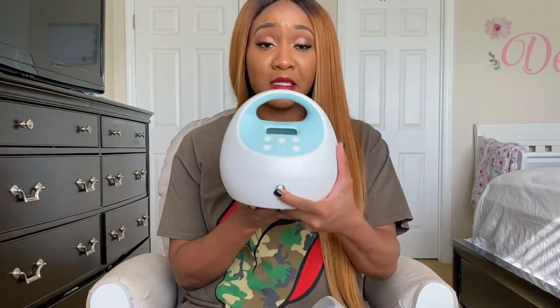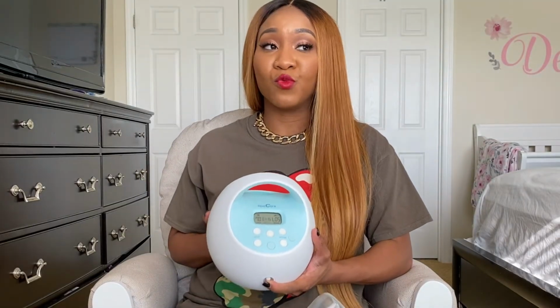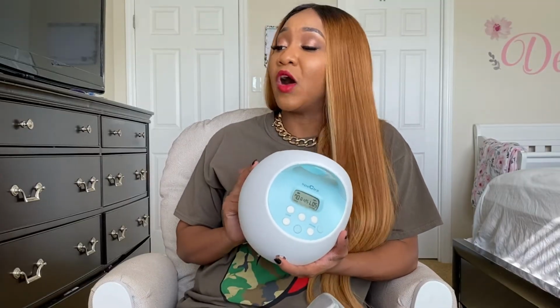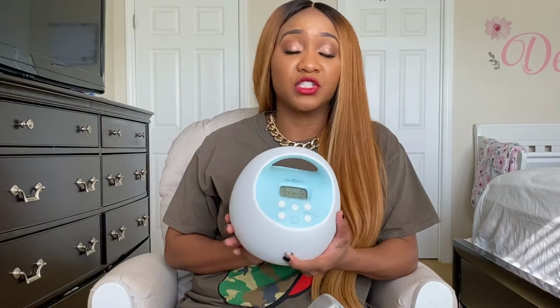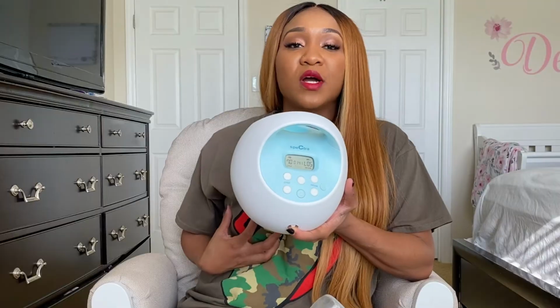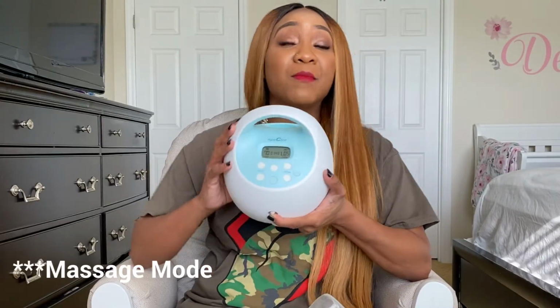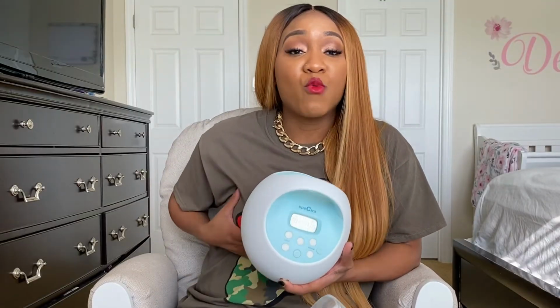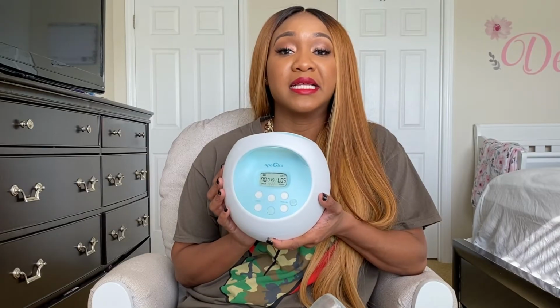This pump is supposed to mimic how a baby sucks on a boob, which to me, when you put the baby on your boob, the baby just sucks. I didn't know the baby had all kinds of rhythms, but I'm not here to judge that. I'm just here to relate a message. You only want to be in this mode for maybe 2 minutes max, until your letdown comes.